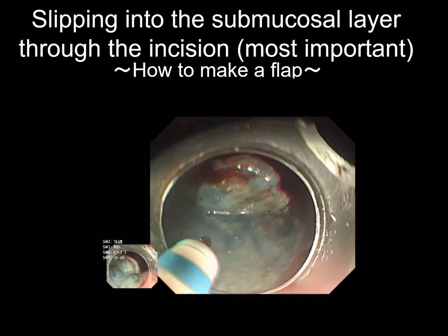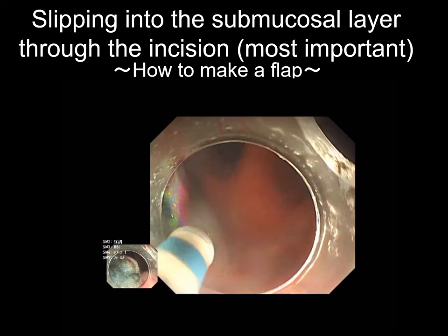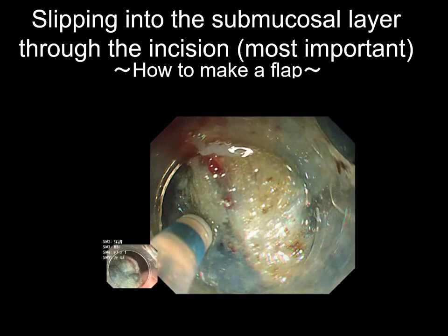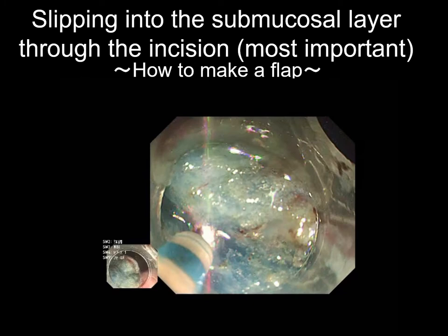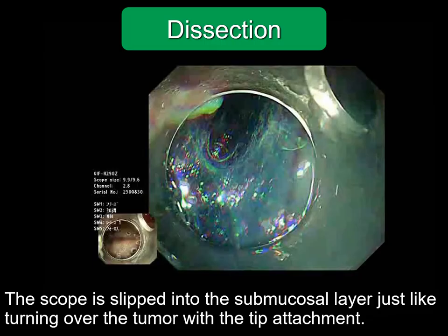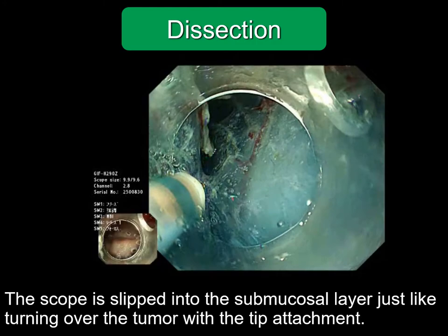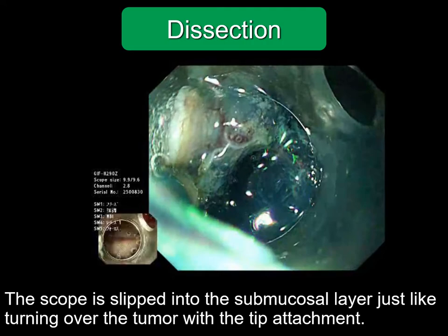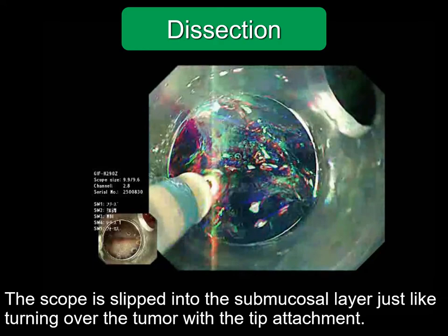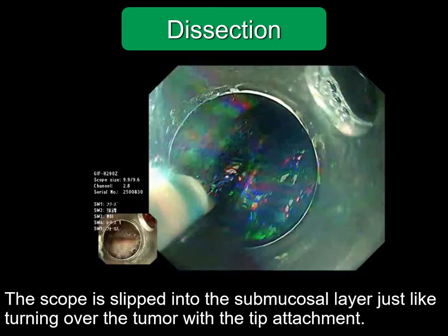Once inserted, I just dissect this blue submucosal layer. If you push and press the scope before widely opening the submucosal space, the knife touches the muscle layer which may cause perforation. Slipping into the submucosal layer is like turning over a shop curtain with the left hand and entering the shop. When no blood vessel is present, sharp and speedy dissection can be applied using the cut mode.